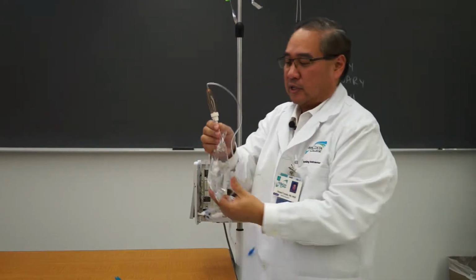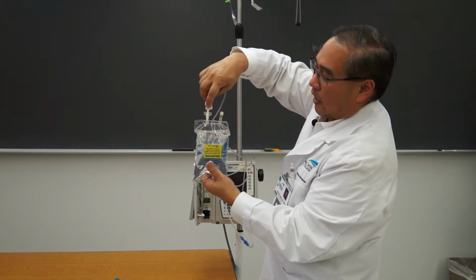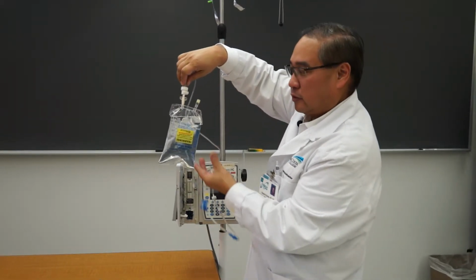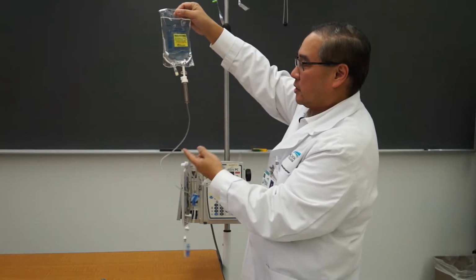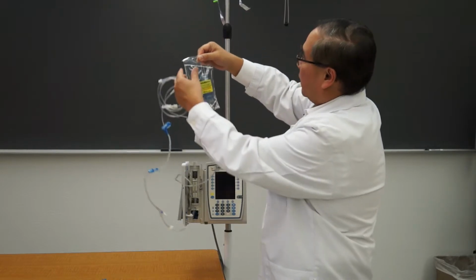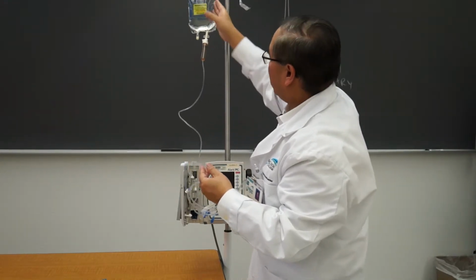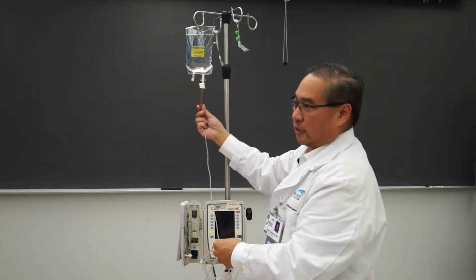Okay, in that case right here, you can see how I have it inverted here with the drip chamber, and I have it up to the collar there. Now, because I've put the roller clamp on, it's not going to start to drip because it's a sealed system right now. So with this, I'm going to hang this up onto the IV pole. It is the only thing I'm hanging right now, so it'll be up to the highest point. Okay, and then here's the drip chamber that's currently empty.